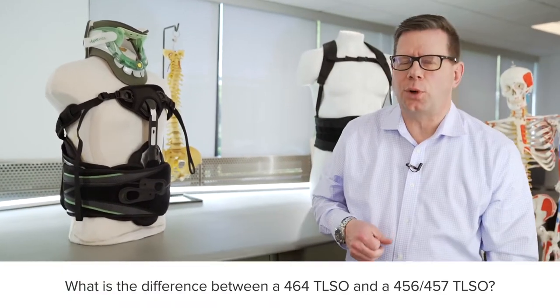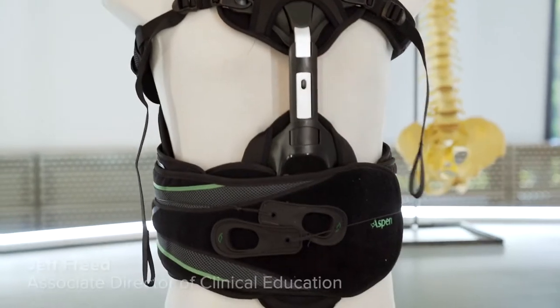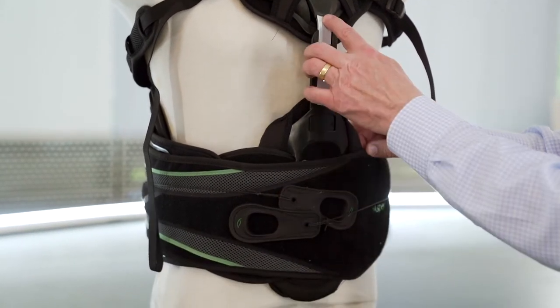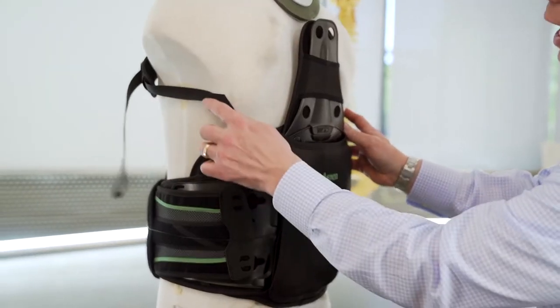What's the difference between a 464 and a 456 TLSO? The 464 is going to be more focused on motion restriction. It accomplishes this goal with a fairly rigid anterior panel, anterior strut, and sternal pad connected to the back panel by straps.